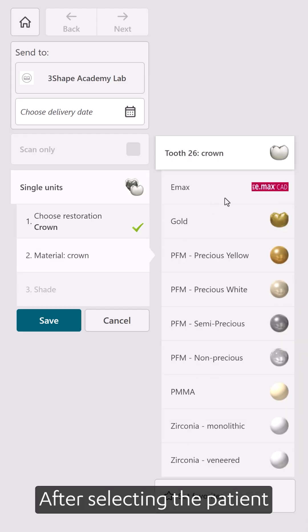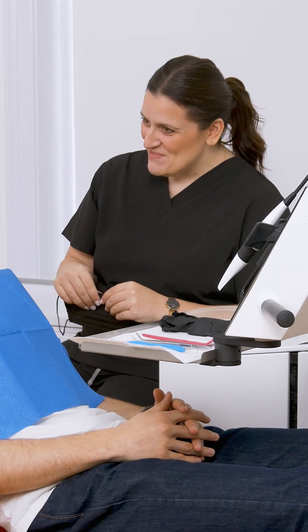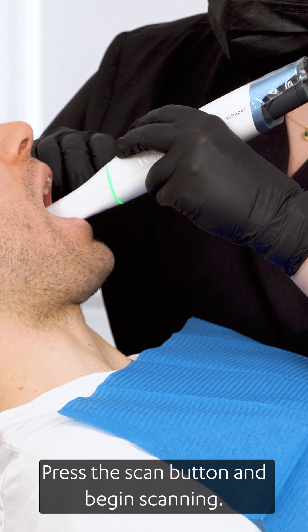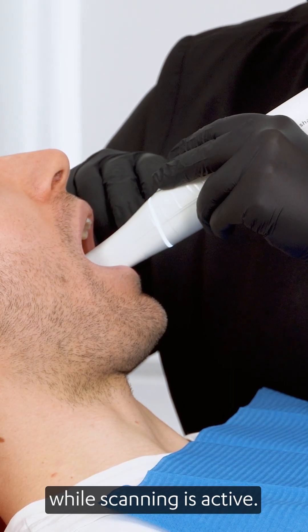After selecting the patient and deciding on the case details in the order form, it is time to scan the patient. Hold the scanner properly, press the scan button and begin scanning. The LED ring will change to white while scanning is active.